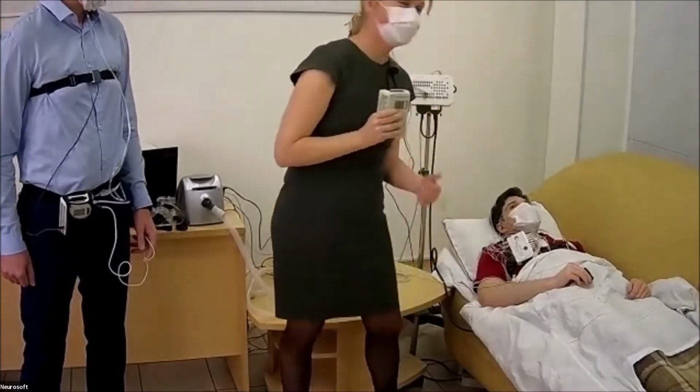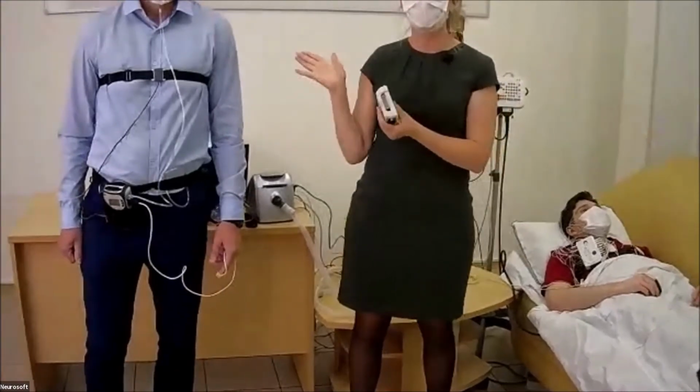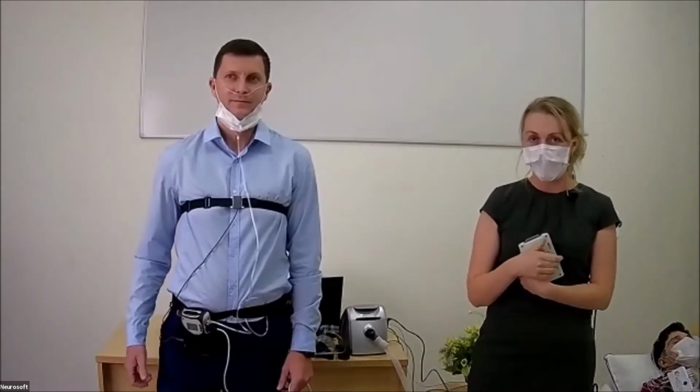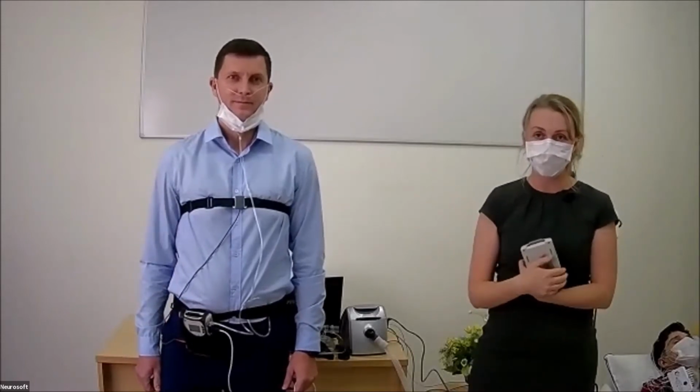Okay. So once our patient has all the electrodes and sensors, we connect them to the unit. And this test very often can be performed at the patient's home. And in this case, we call it cardiorespiratory monitoring.